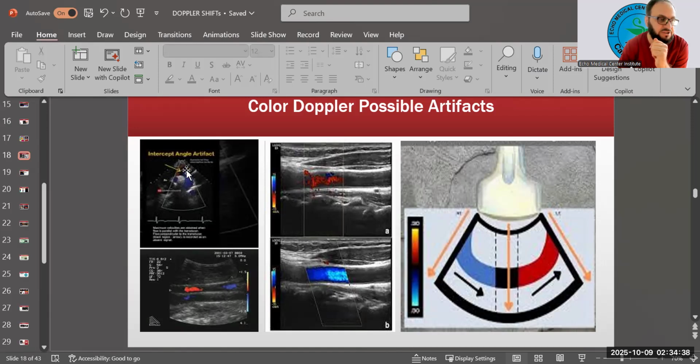And the aortic arch, look at here, ascending aorta, descending thoracic aorta, but this is completely 90 degree angulation on that area. You don't see any flow on that area. It looks dark on that area. You can see on that picture. Or somehow here, this area for this color box, it looks like maybe completely 90 degree, exactly 90 degree. That's why we have no flow.